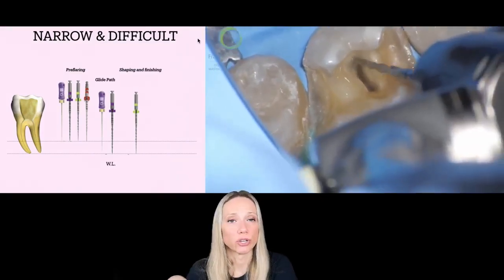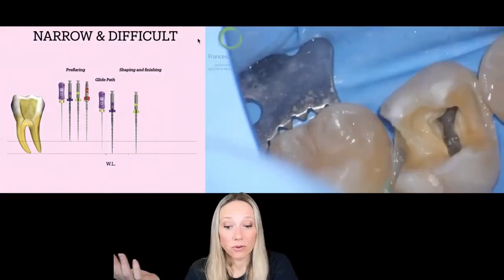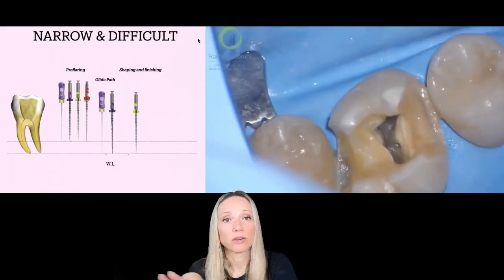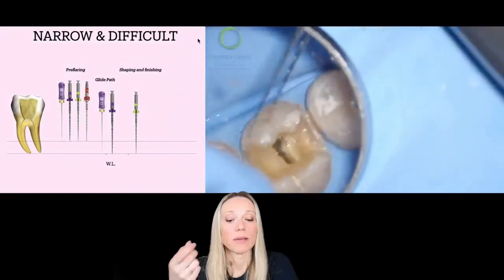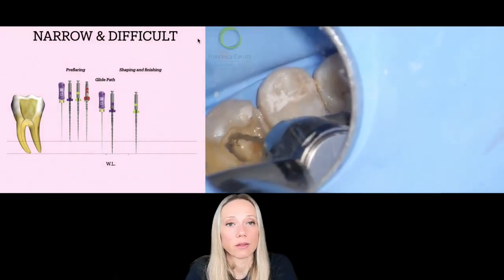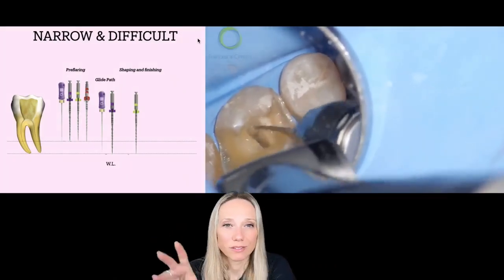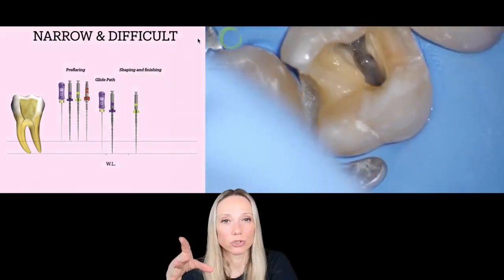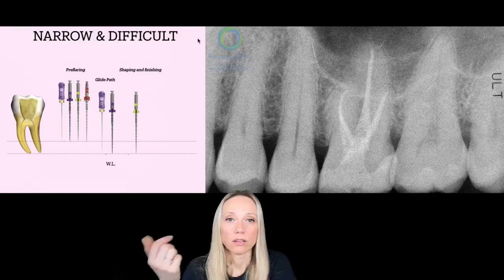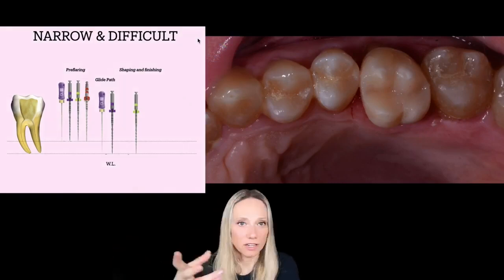And so you use your sequence short to the working length, and you see I'm going also directly into the MB2 canal because I'm quite confident that the cutting efficiency of the file will be enough for me to negotiate also the MB2. And then once I am able to arrive to the working length with my manual file, then I do my glide path with a 1303. And so I arrive there, I just shape a little bit the root canals, and then I'm going to just shape them up to the final size. And so I go with my 2004. If it's enough, I stop there. If it's not enough, I take my 2506, and then I do it. If it's not enough, 3504.